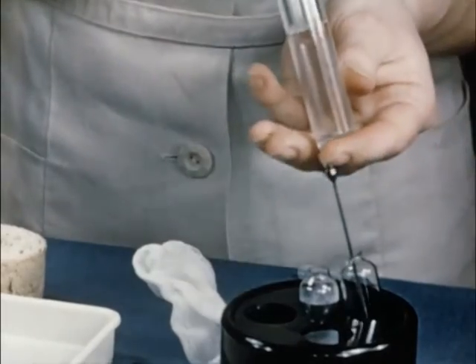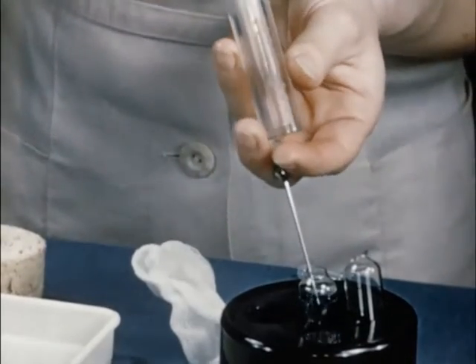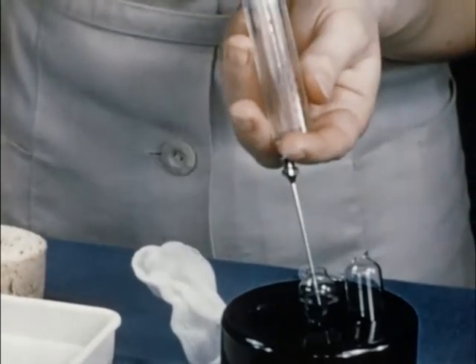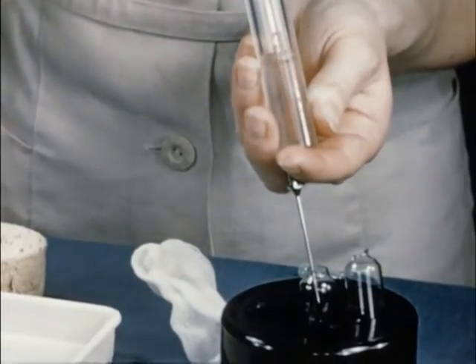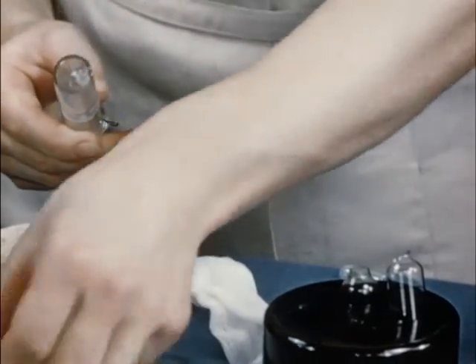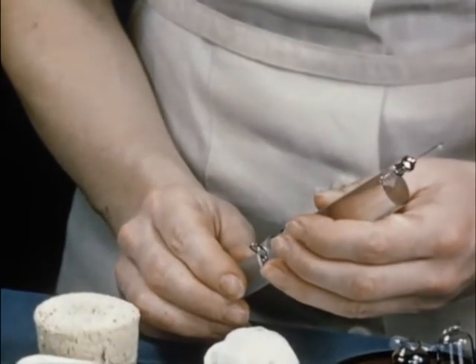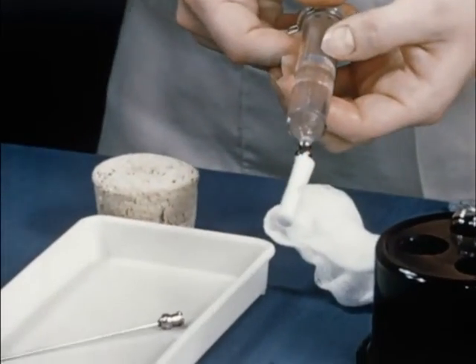This filling needle is three and a half inches long and will reach to the bottom of a 20 millilitre ampoule, the largest used. Note the extra support being given by the two fingers to ensure that the needle is not dislodged by the repeated pumping of the plunger during mixing. After mixing, the required amount of solution is withdrawn and the filling needle firmly replaced by the intravenous needle. Any air bubbles are expelled, the required amount of solution confirmed, the cotton roll replaced, the reading finally checked, and the syringe is now ready for use.